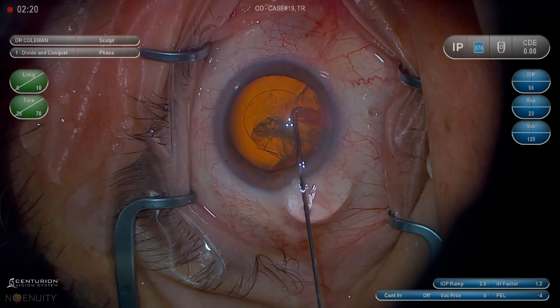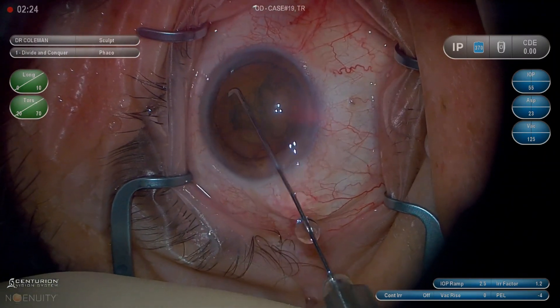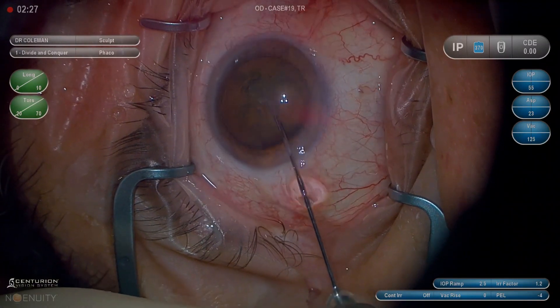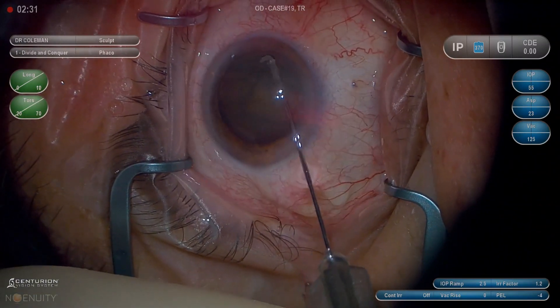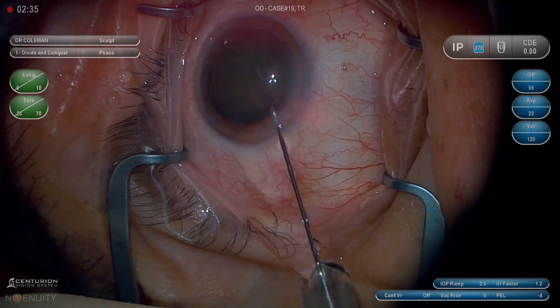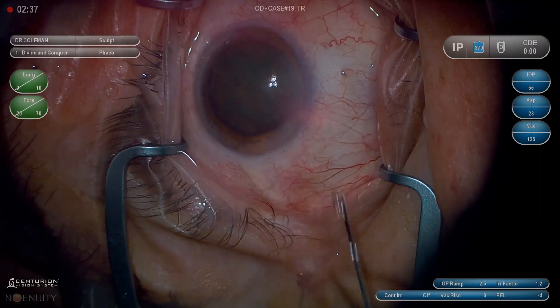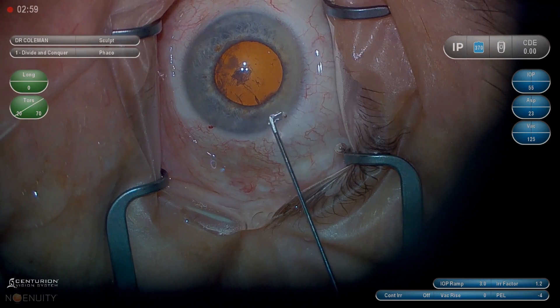Remember with hydrodissection, we're really trying to separate the cortex from the capsule, not the nucleus from the cortex. Many people value hydrodelineation, which would be a fluid wave between the nucleus and the cortex — the golden ring sign. Everybody wants to see the golden ring sign, but my view is I don't want to see it. That's the one thing I definitely don't want to see.